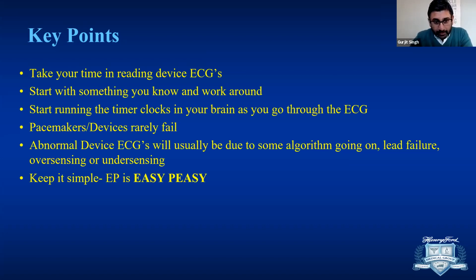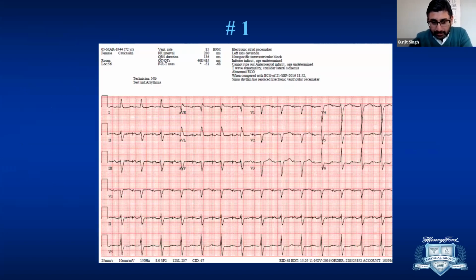All right, let's go. So first case, this is an ECG showing some paced complexes. I want somebody to volunteer and tell me what else do you see besides the atrial pacing? Wait for 5 seconds. If no response, then I'll take over. Okay, so everybody, can you see my cursor? You can see my cursor.